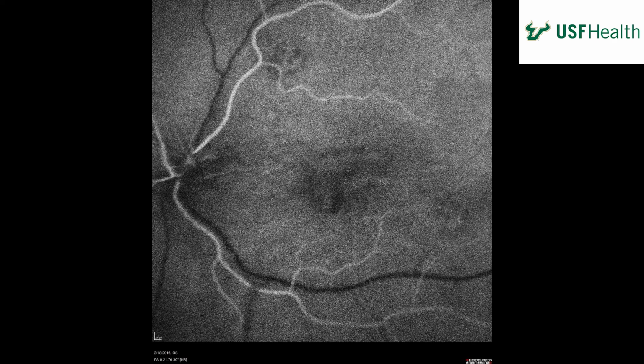Oh, okay. So I would say 9. You're very good. I appreciate that. So yeah, I'd say 99% of the time that's probably right, or 95. But this is so autofluorescent, I think it's overriding. Well, I could be wrong, but let me see. Otherwise, it's a window defect. But I think it's just hyperautofluorescence. Okay. But I think that's true, Scott. You're absolutely right. Usually, because it's a signal to noise thing. So usually as soon as the fluorescein gets to the eye, the autofluorescence disappears.